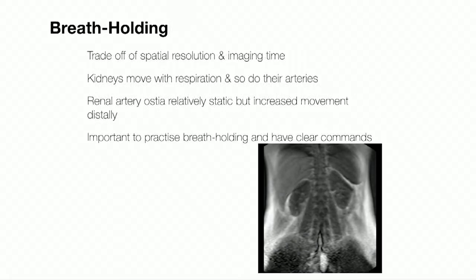So breath holding, this is a really important part of renovascular MRA. The kidneys move with respiration, and so do their arteries. Okay, so this should be a movie. Hopefully, it'll work. Oh, no, it's not moving. Should go back.